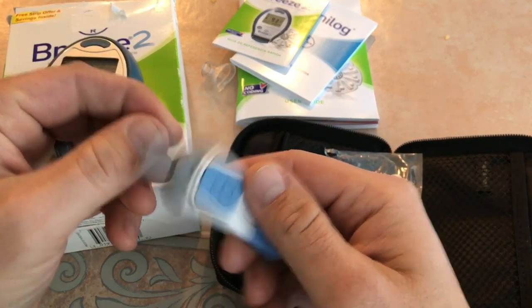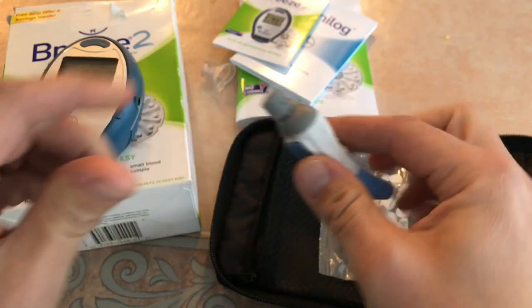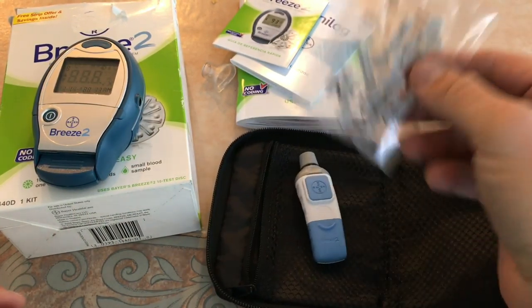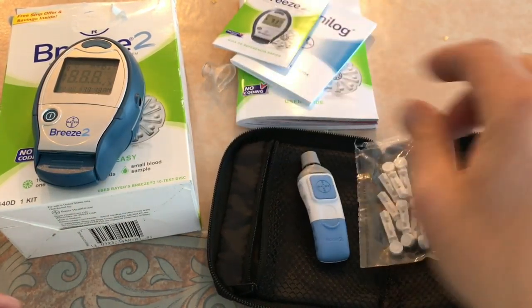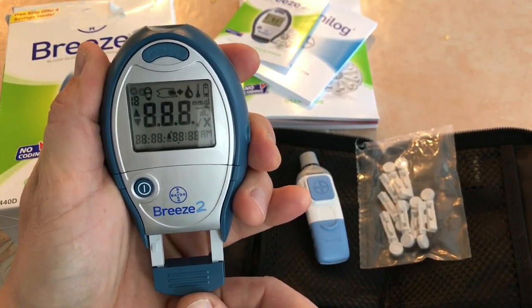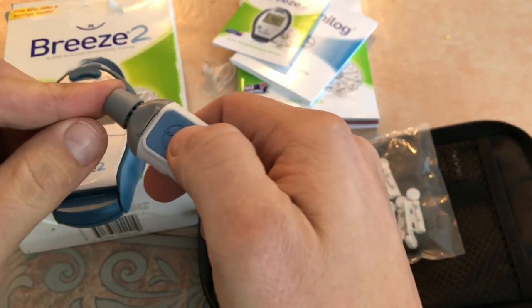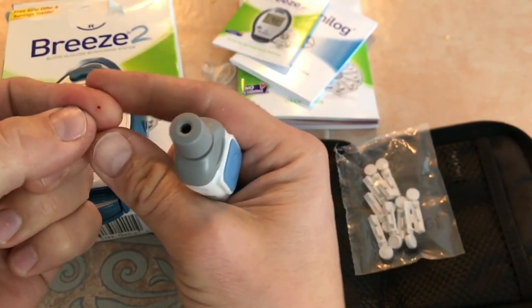There's the poker — that's what's going to give you the drop of blood. You can obviously control how far you get stuck by it. It comes with a pack of pokers and is super easy. Pull down and push up and you'll see at the top there's a new strip ready to go. So it's time to poke the finger. I always do hate the click, but it doesn't hurt.